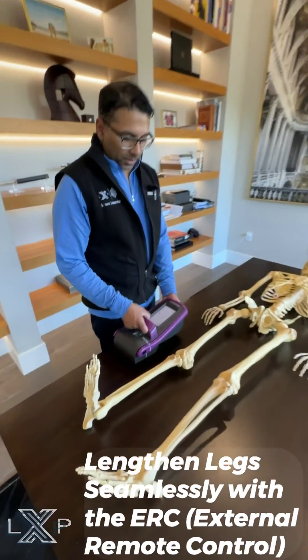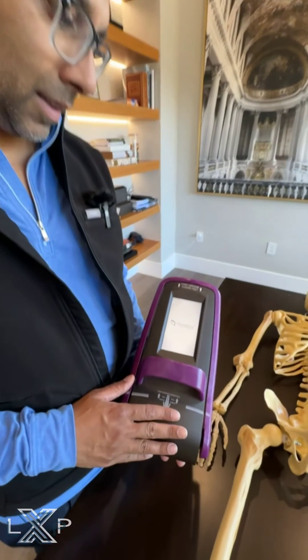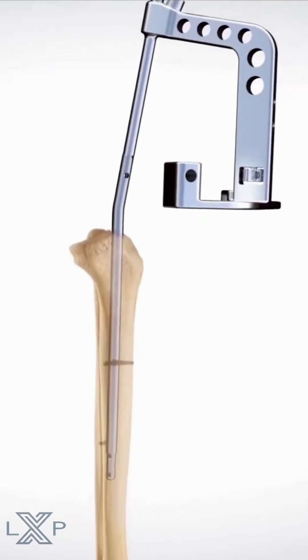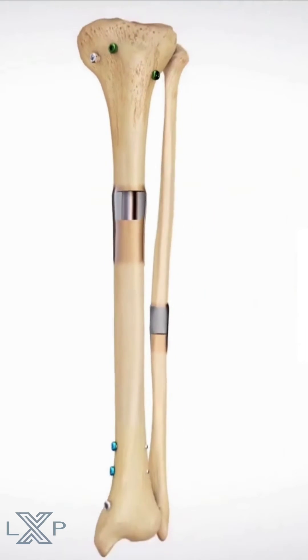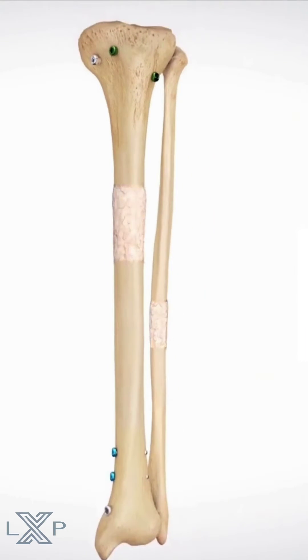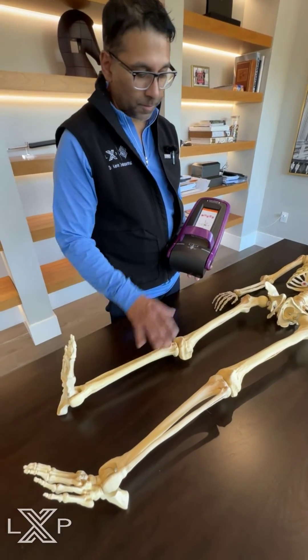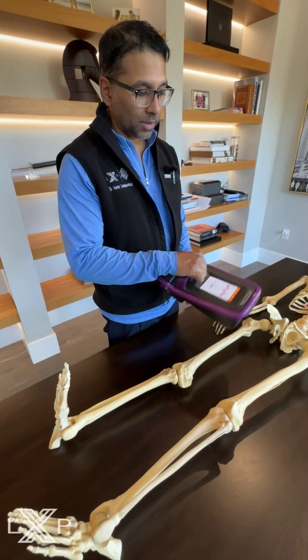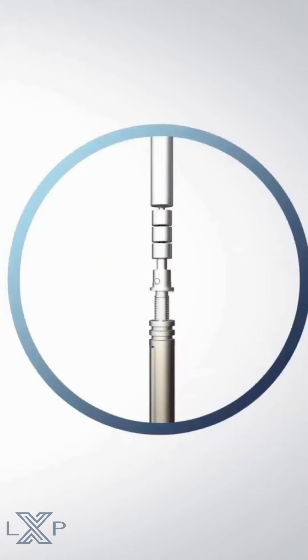Here's an example of the ERC-4, the external remote control, used for lengthening the actual device. This device will be placed over the area where the implant is positioned — for instance, if it is placed into the femur versus placed into the tibia, it will be placed onto the leg by the patient. It then communicates with the actual nail itself and facilitates lengthening.